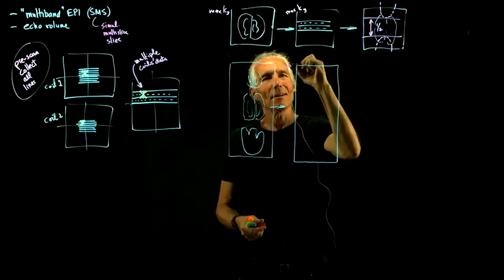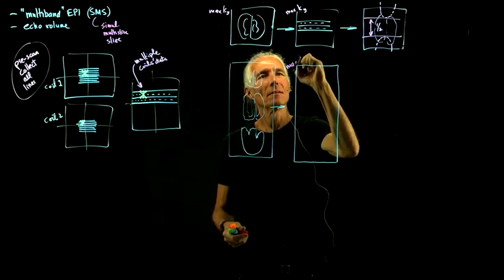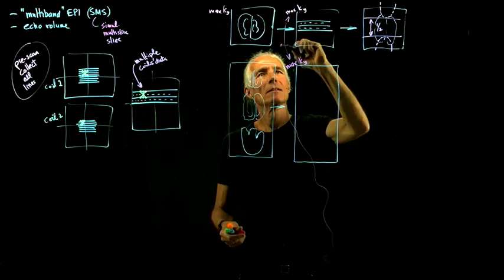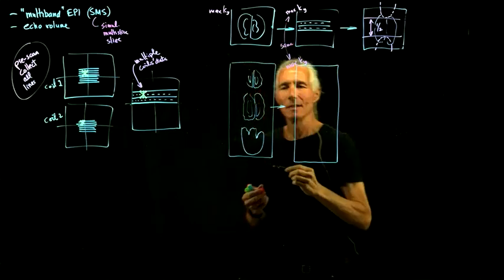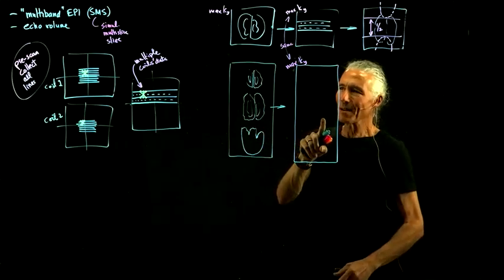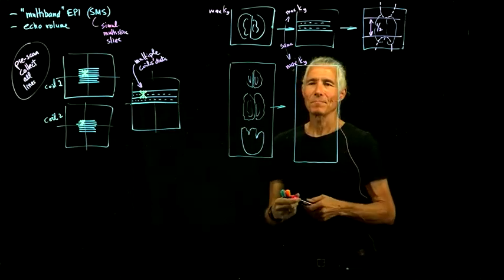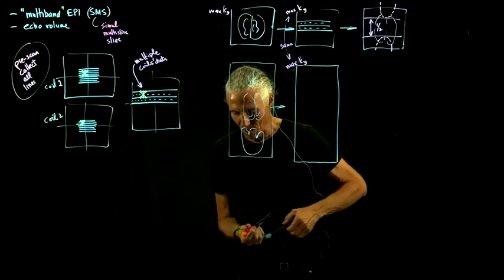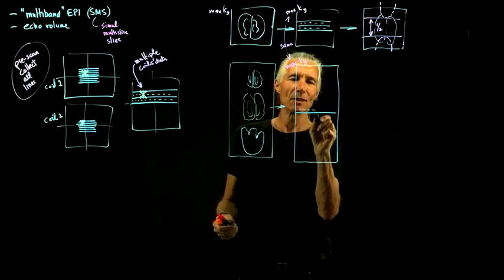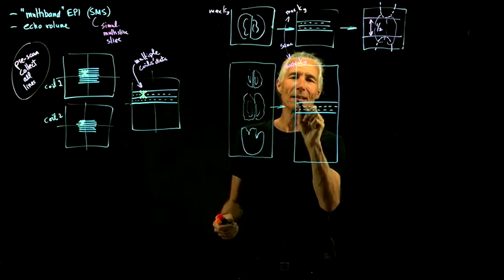Here's max ky, say those are the same, max ky, so these guys are the same, even though I drew it as a rectangle. Okay, so it's as if we left out some lines. So if we had just recorded 1 line and then left out 2 lines, and then recorded another line and then left out 2 lines.